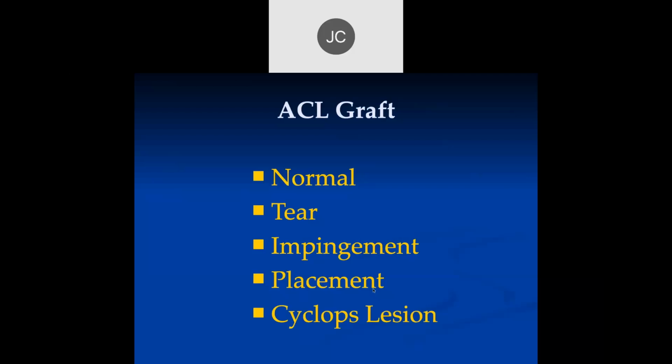In fact, you'll see some studies where the surgeon wants us to do CTs to look for the bone tunnels to see if they need to pack them before they put in revision grafts. But the problem is that if they go on to have some instability and it doesn't work, and you then develop degenerative disease or meniscal tears, then obviously you're not going to have as good a prognosis in that knee as if you had put the graft in at the beginning, which might have helped protect the knee.